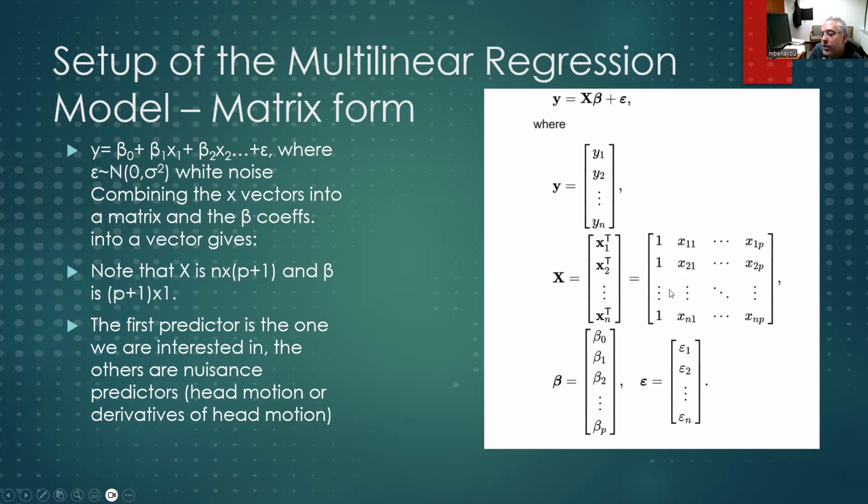And so you would have a beta for this column, and there'd be another beta for the head motion. When you solve this problem and find all the correct betas, you may take some of the value of beta away from here if you're able to fit some of the data with some of these other regressors.